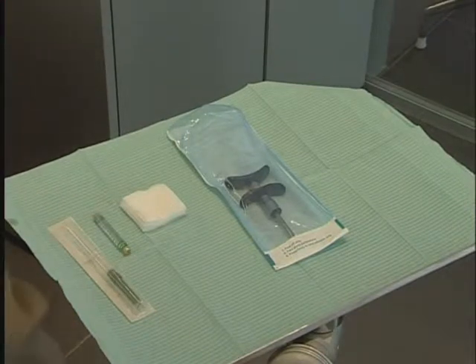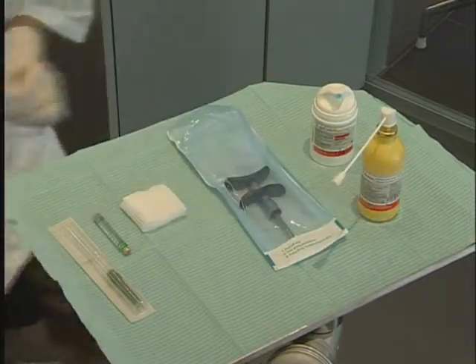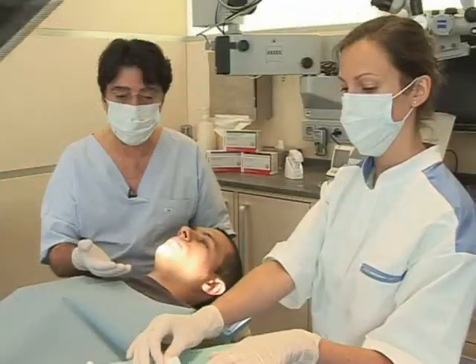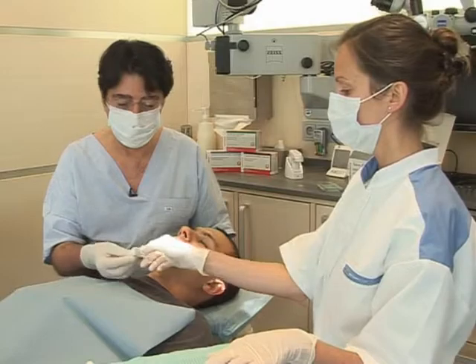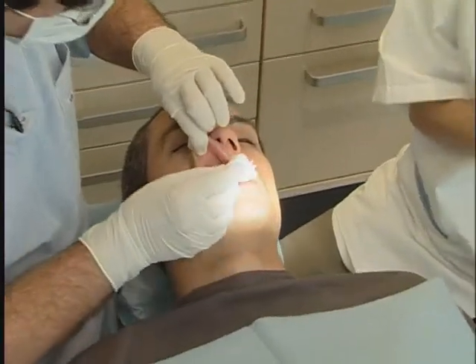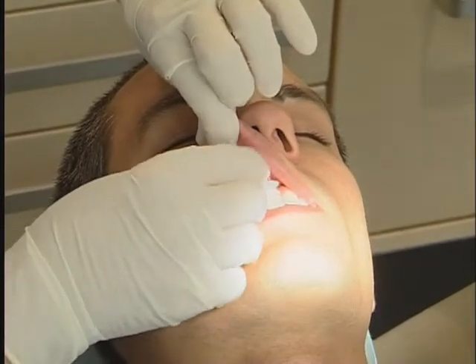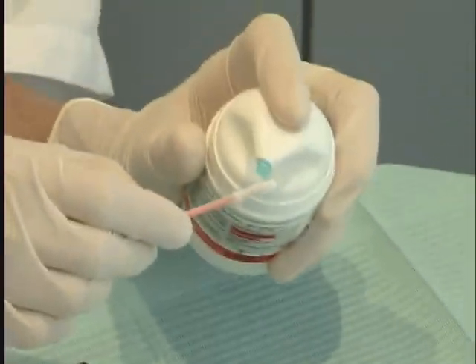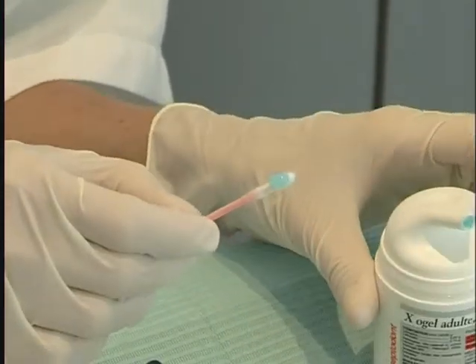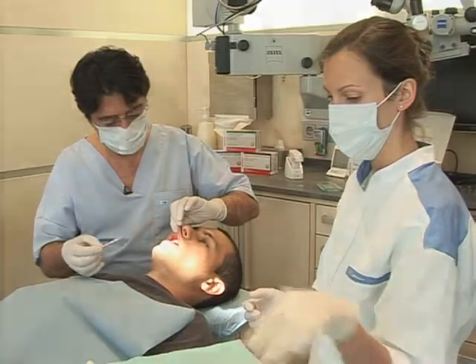We will perform the anesthetic procedure via the right lateral incisor route and show the different stages in detail. The soft tissues are drawn aside and wiped with a sterilized gauze so that the area can be seen properly. The mucous membranes are swabbed with a cotton pellet impregnated with a surface anesthetic.